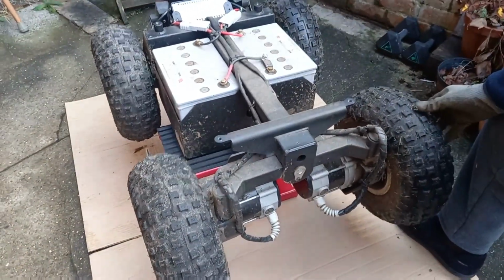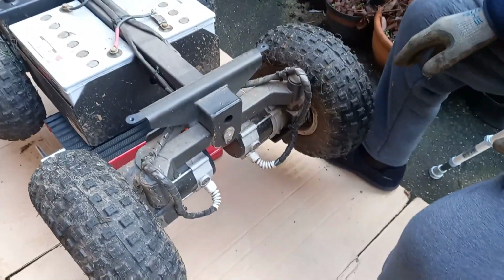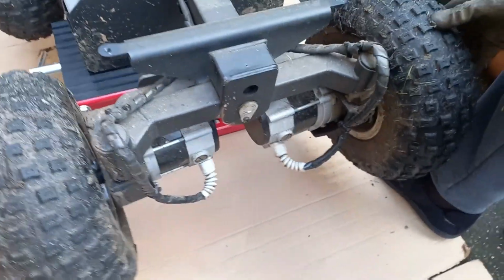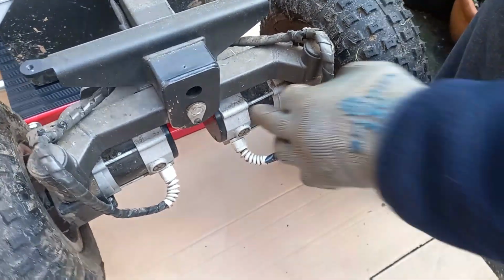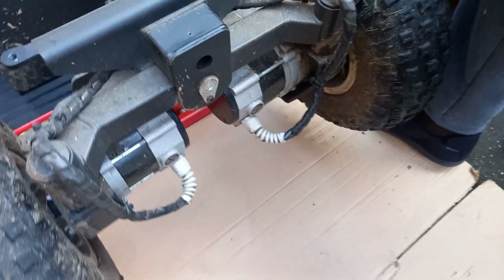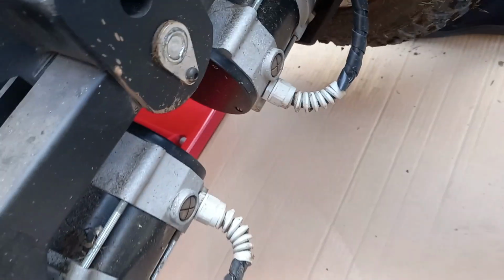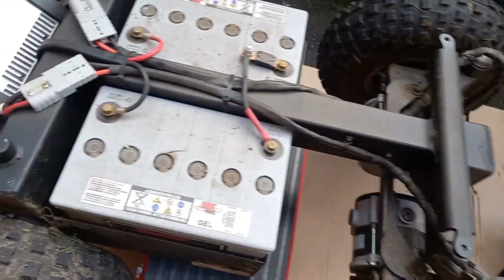This is the Magic Extreme stripped down then to expose the batteries. You can see the drive motors on the front. You can see the way the front axle swings about like that and how it all turns and everything. I'm a bit disappointed that they haven't put a grease nipple there for the main pivot, really. I can't see any way of lubricating it, but there will be like a bush in there, I presume. Well, I hope there would be a bush.